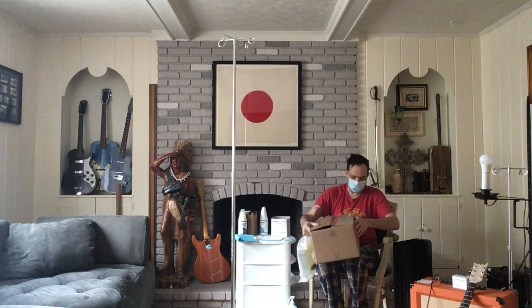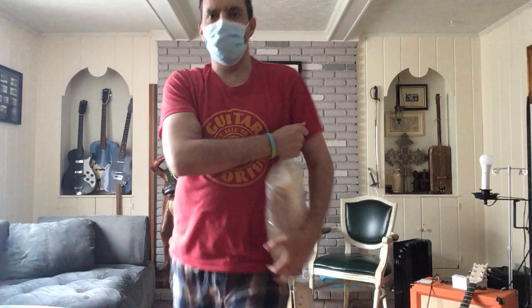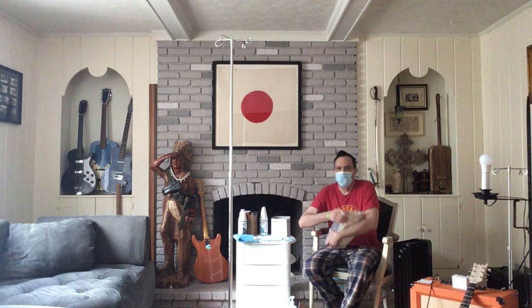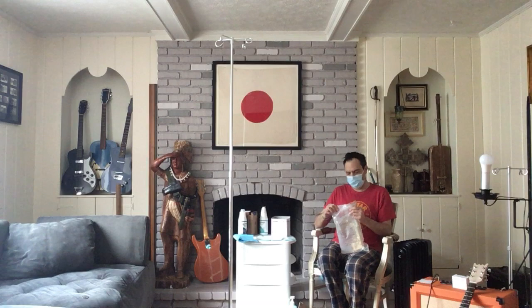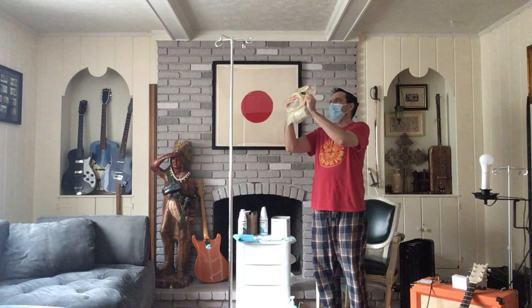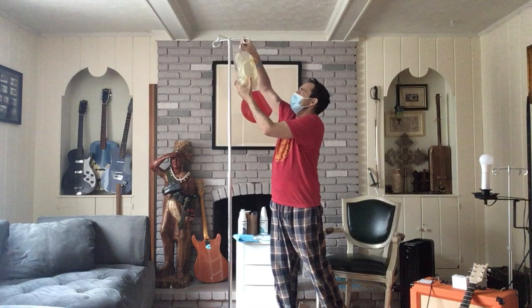Check your percentage of fluid. This is 1.5%. Sorry, I had a battery issue. There are varying percentages of fluid, but this is a lower percentage. It takes off less fluid than, say, your 2.5%. Now, you want to check the bag for leaks, abnormalities, anything like that. You're going to hang it on the pole.